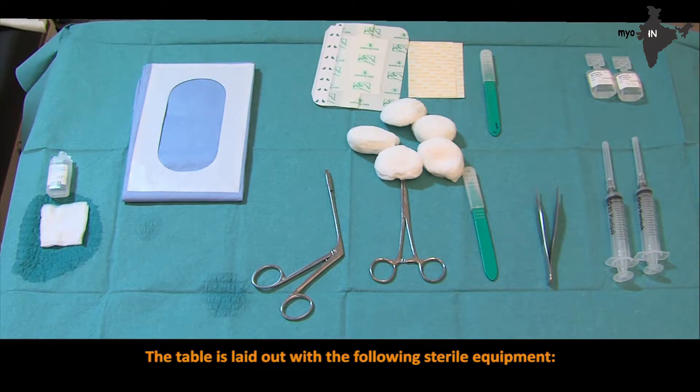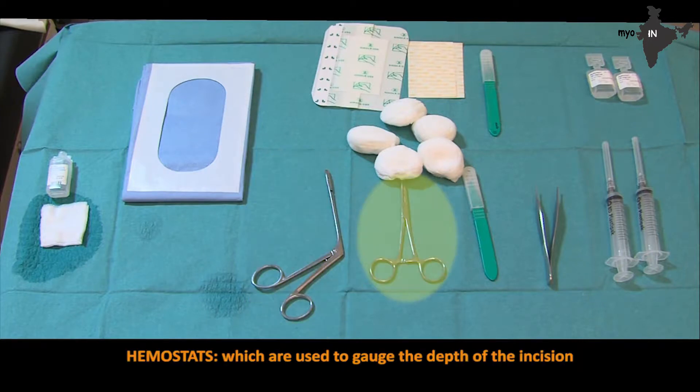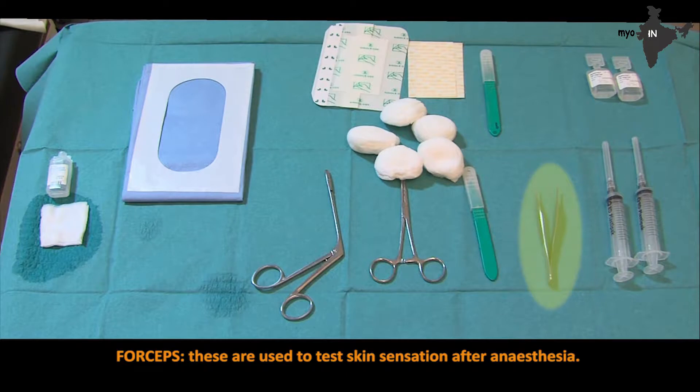The table is laid out with the following sterile equipment: gauze 5×5 cm slightly moistened with 0.9% sodium chloride, upon which the specimen will be laid — if too wet, the specimen will overhydrate. A windowed procedure drape — an epidural window drape is ideal. A conchotome. Hemostats, which are used to gauge the depth of the incision. Scalpel number 11 — two are on the table, one for incision and one for research preparation. Forceps, which are used to test skin sensation after anesthesia.